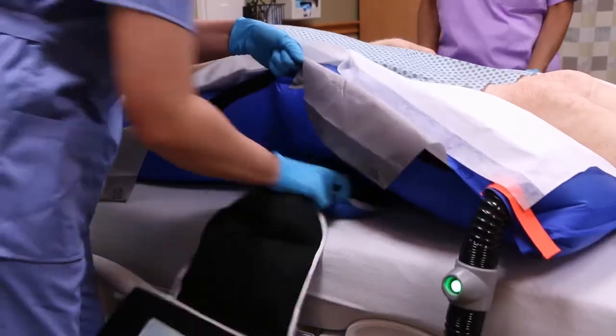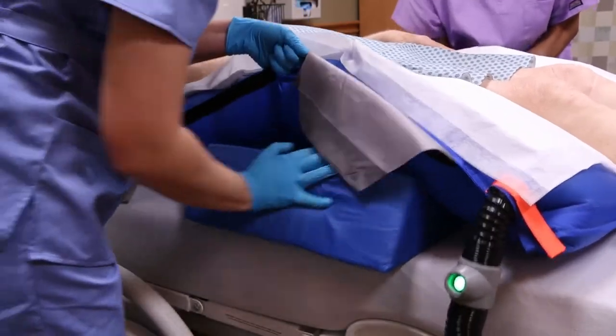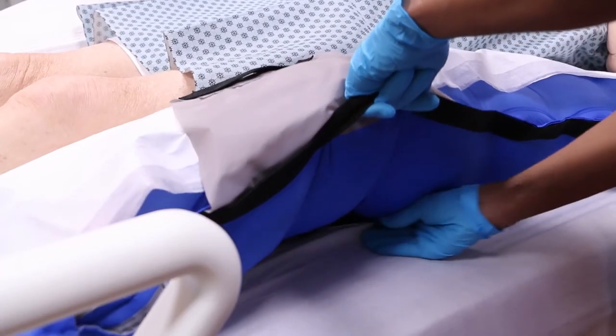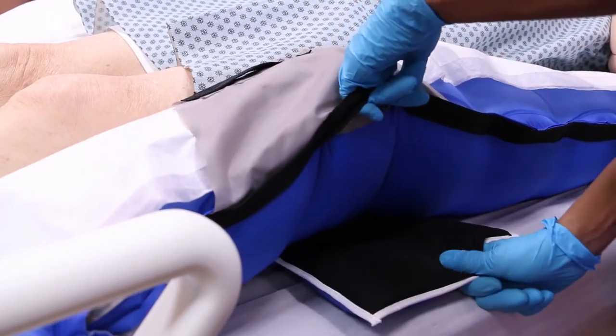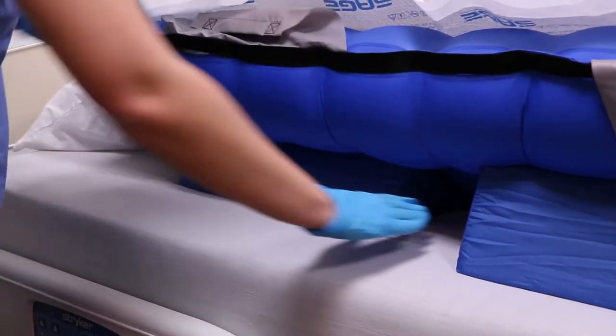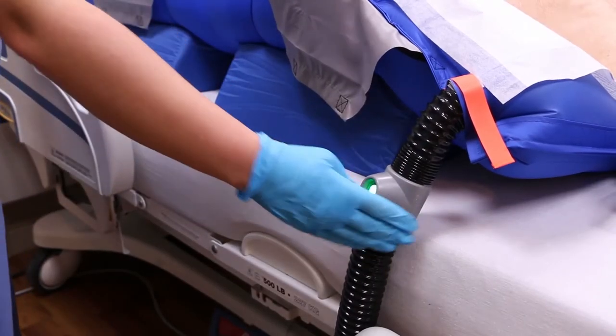Lower the bed rail on the side of the bed where the wedges are being inserted. Insert the anchor wedge tail first with the black fabric facing up. The caregiver on the other side of the bed will pull the anchor wedge through until the tail is taut. Place the upper wedge at least one hand width away from the anchor wedge. Turn the booster pump off.